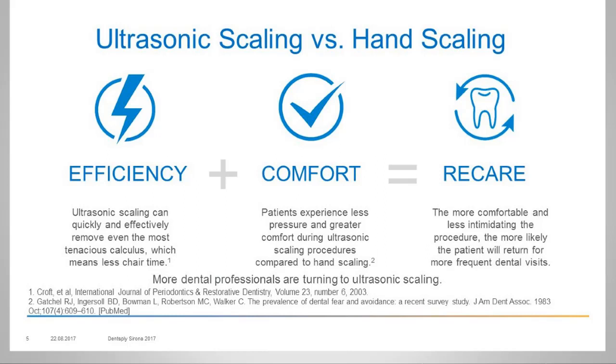Ultrasonic scaling can quickly and effectively remove even the most tenacious calculus, which means the patient is in the chair for less time. And patient comfort. Patients experience less pressure and greater comfort during ultrasonic scaling procedures compared to hand scaling. And this creates what I would call a win-win. The more comfortable the patients are, the more likely they are to return.